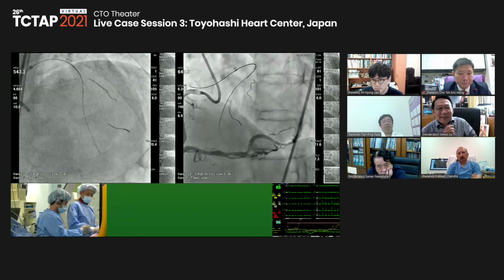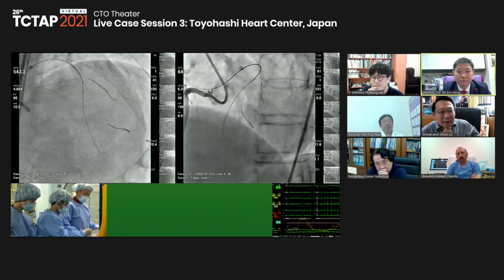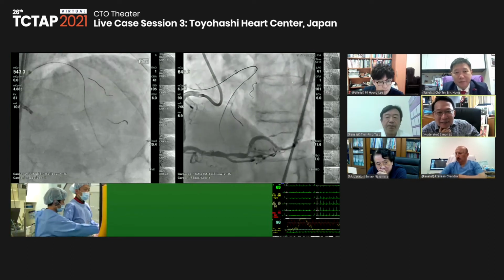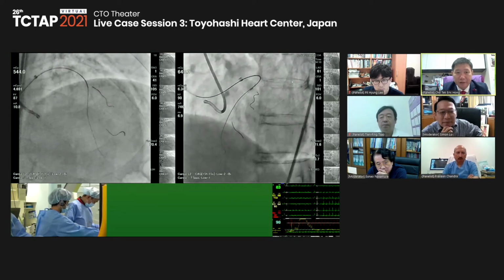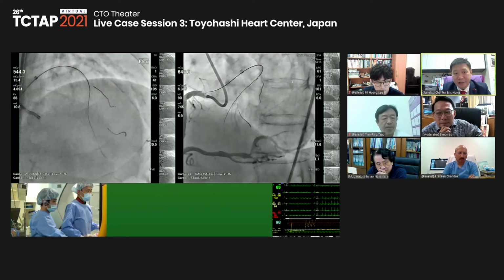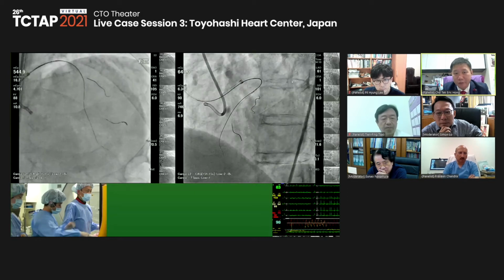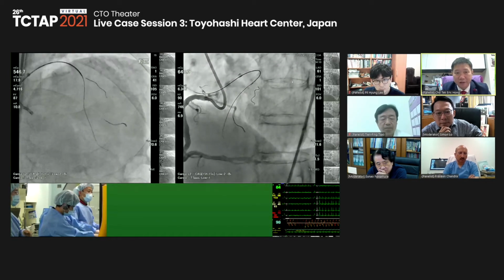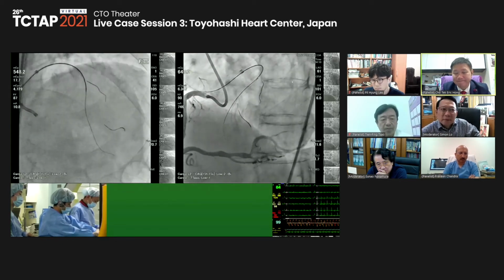Would you use a two-stent? Can you hear me? Yes, I think my preference is still towards a single stent strategy, with the diagonals being quite acute. Depending on the size, I may just use a small balloon to inflate, with the idea of using a drug-eluting balloon for the diagonals if necessary, and hopefully not to do a kissing balloon.